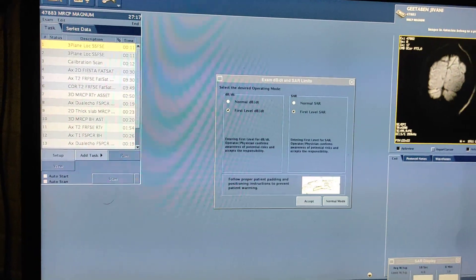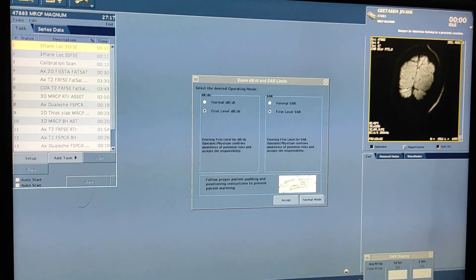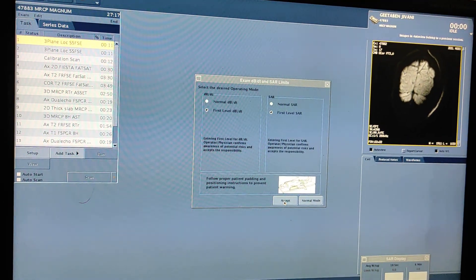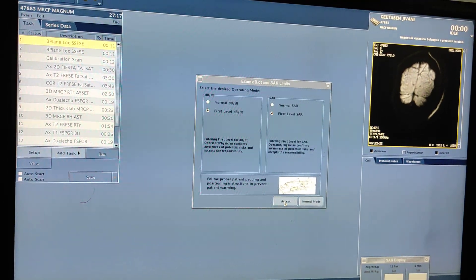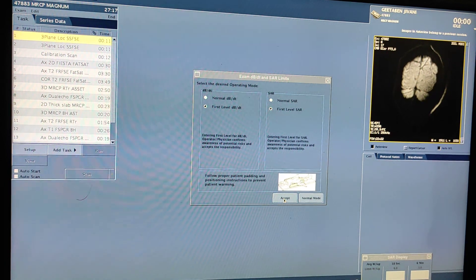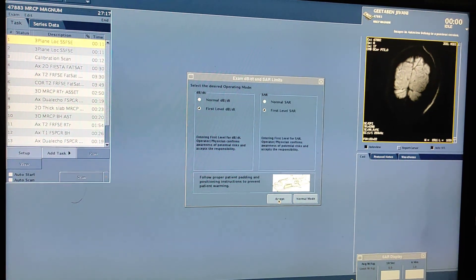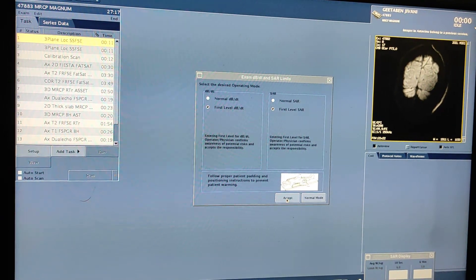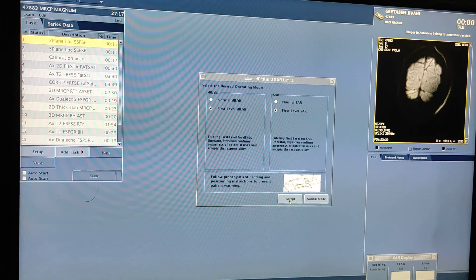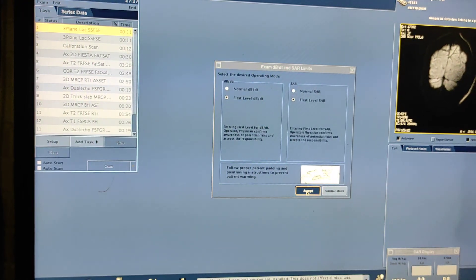Always before starting the scan you have to take the patient history — whatever complaint the patient is having. If the patient's creatinine level is high and BP is also high, accept the scan accordingly.